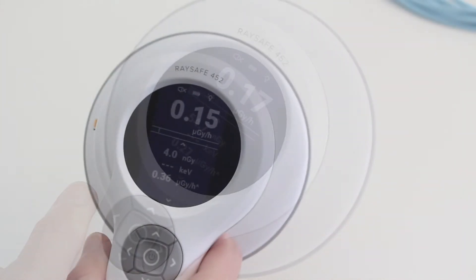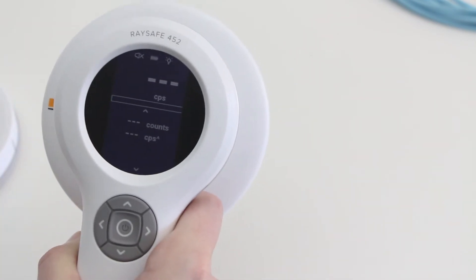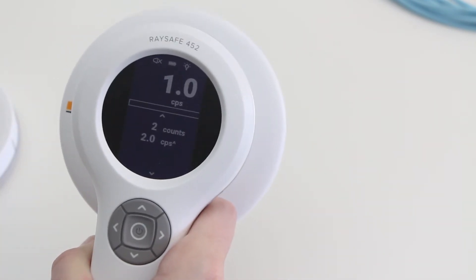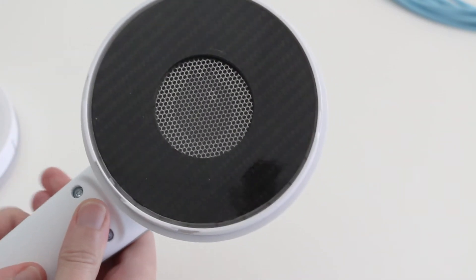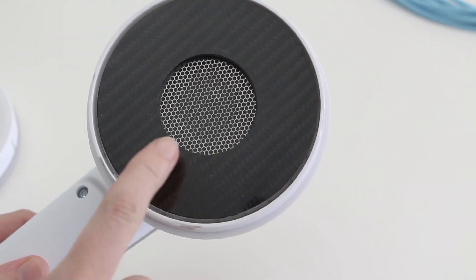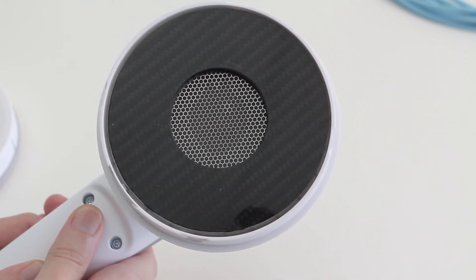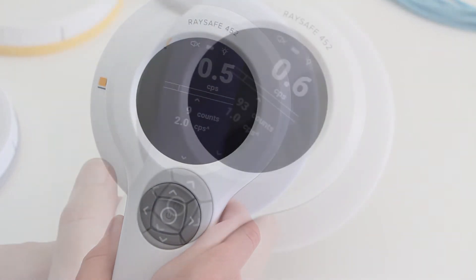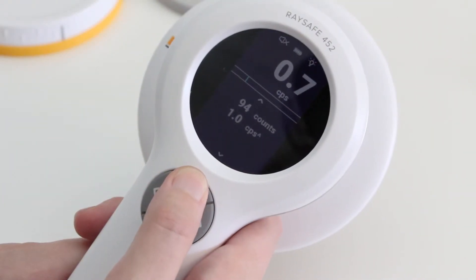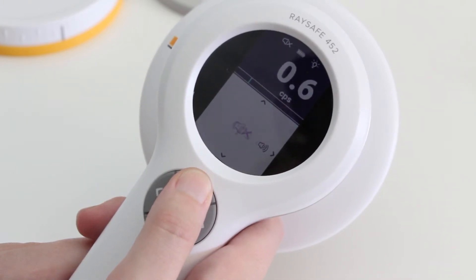To measure counts, you take the lid off. The quantity automatically changes to counts without any manual settings. The active sensor area is now limited to this steel grid, which protects the Geiger-Müller pancake. The counter can measure in counts per second or counts per minute.